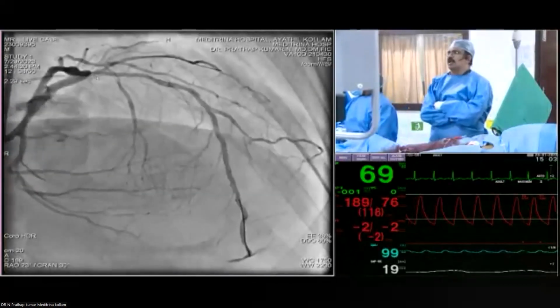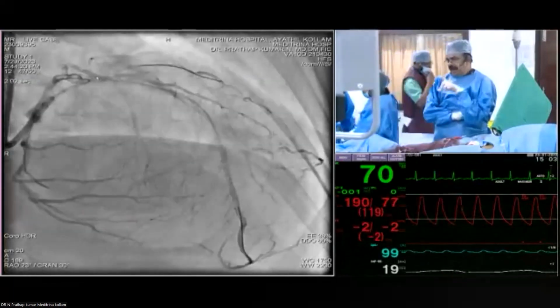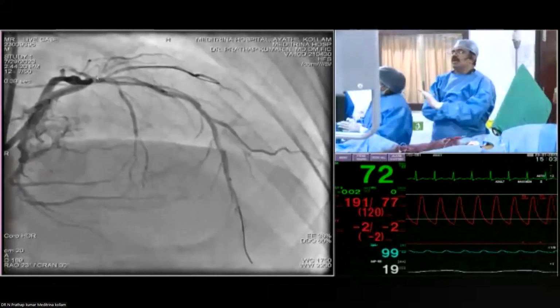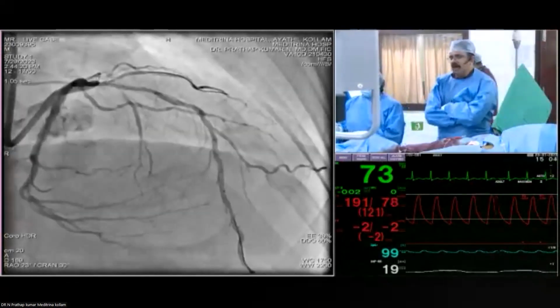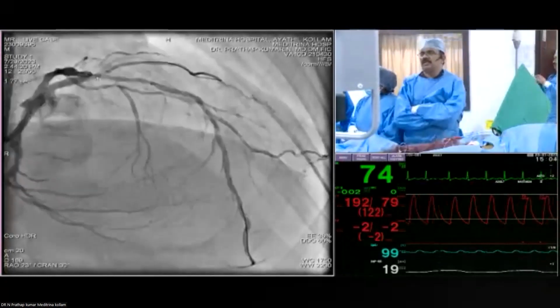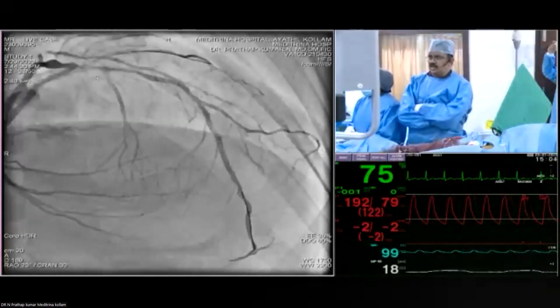So I don't want to take a 3.5 and take two cutting balloons. I'll take one cutting balloon and dilate the circ ostium. Then I take the same cutting balloon and dilate the LAD ostium, and then I do a pre-dilatation of the LAD part, again with the 3.5 millimeter balloon in the ostioproximal LAD, and then I will do a DK crush. What is your suggestion?